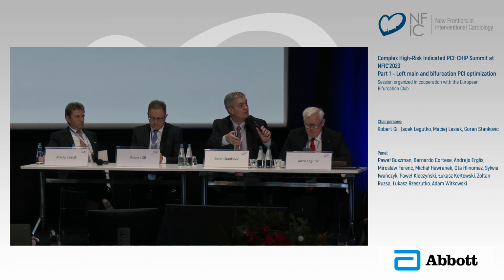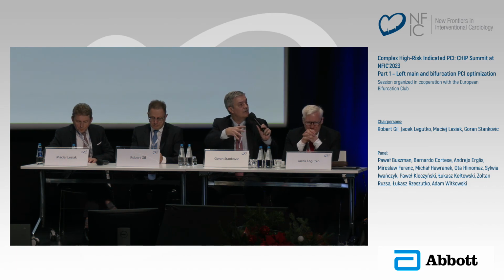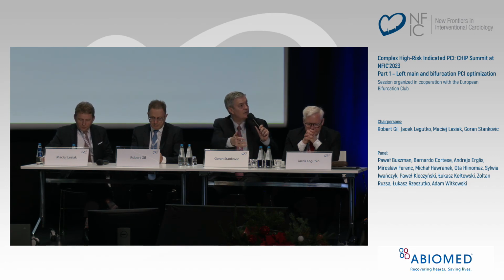We don't routinely do kissing, and we don't really use all the technologies to optimize expansion. This is probably one of the reasons why two-stent strategy, with a lot of metal unopposed in the polygon of confluence, changes the flow. Plus, with two-stent strategy you have a change in bifurcation angle and restriction of movement during systole and diastole. But we don't have clinical evidence for that.